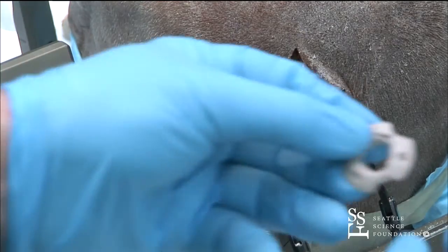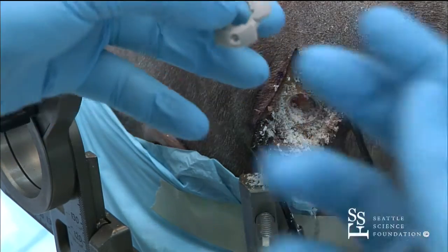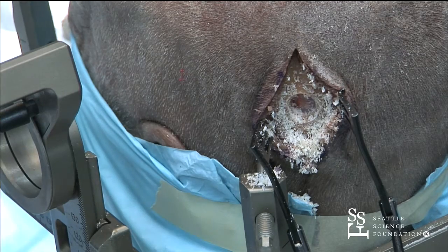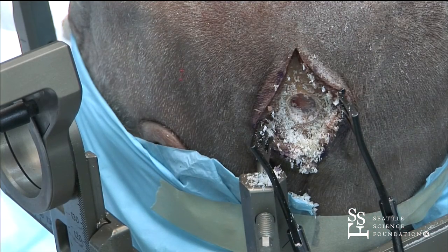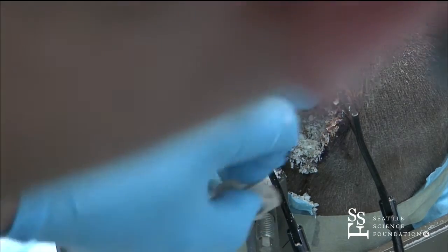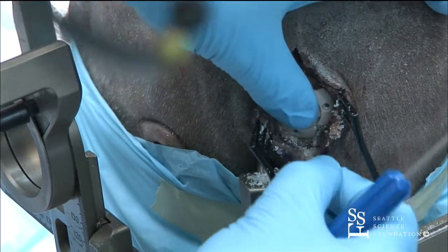So there's no temporary locker, so you have to be a little bit more careful while you're taking everything apart that there's no movement. And generally you have to use a plating kit because there are no screws included with the burr hole cover, so you have to use whatever system you have for cranial plating.